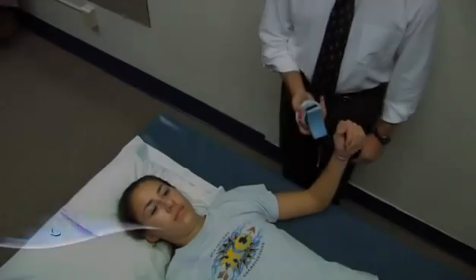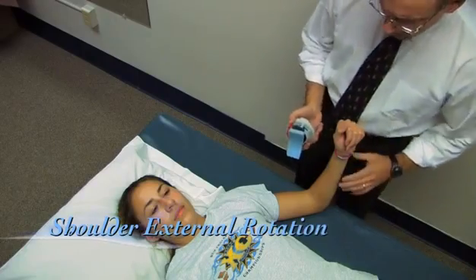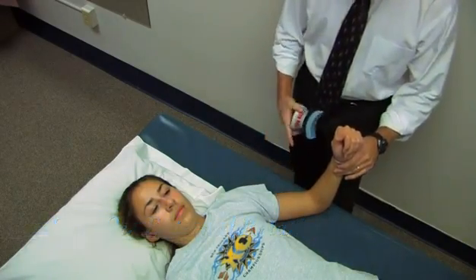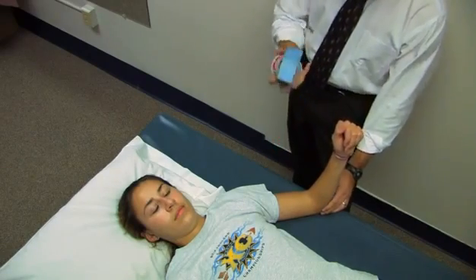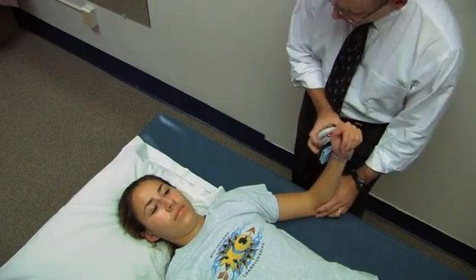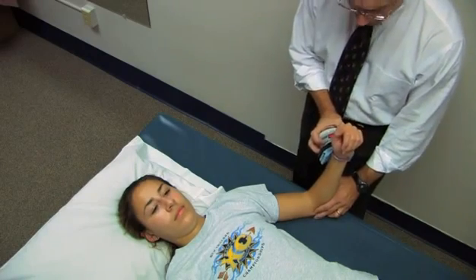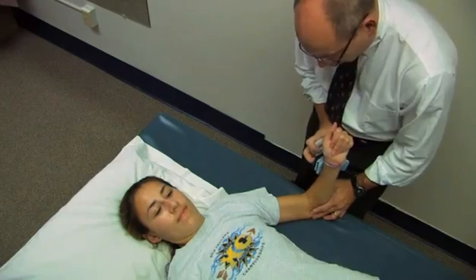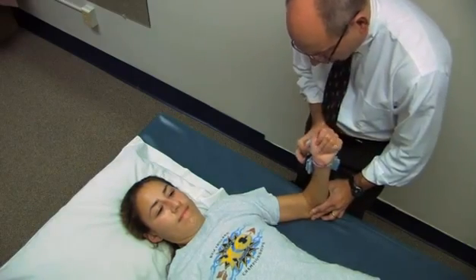Now we're going to measure shoulder external rotation. Her shoulder is at 45 degrees of abduction, her elbow is at 90 degrees. I'm going to stabilize here and place the dynamometer just proximal to the styloids. When I say go, take a second or two to your maximum effort. Go ahead — harder, harder. And relax.